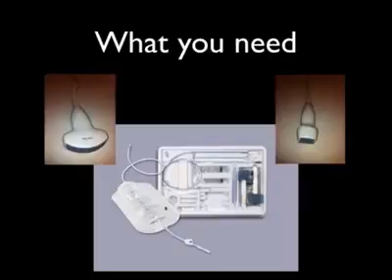Of course, you'll also want a pericardiocentesis tray. Now, you don't have to have one of these. If you're not placing a catheter, you can simply use a spinal needle and a large syringe. However, if you do want to place a catheter, I recommend you keep a pericardiocentesis tray in your emergency department.